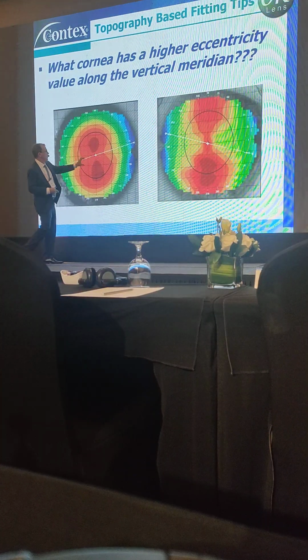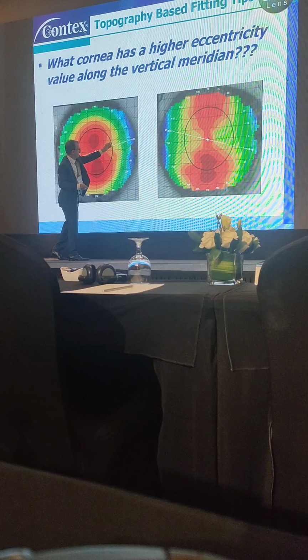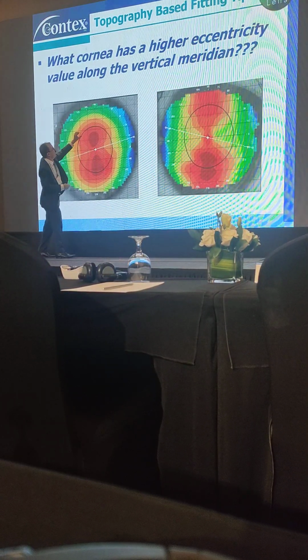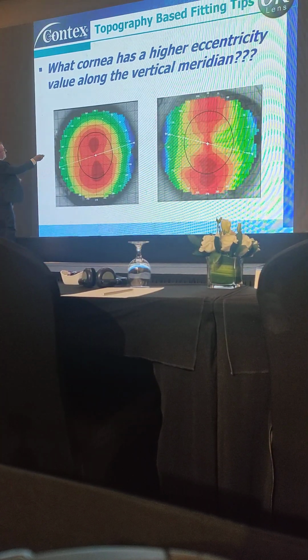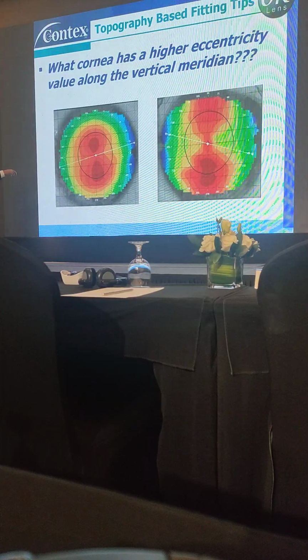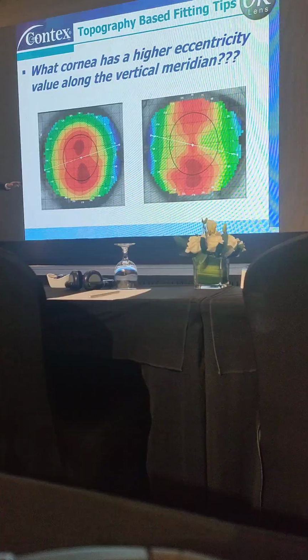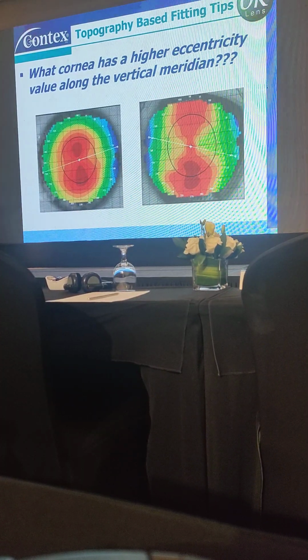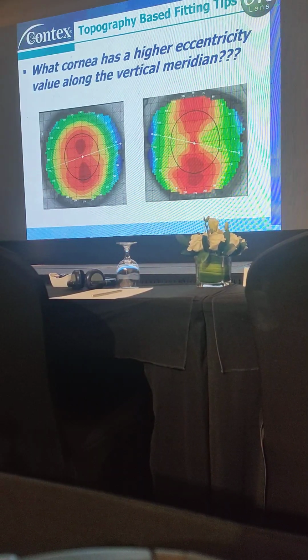So maybe we have the reverse curve coming around, and in this quadrant it's flatter, here we make it steeper, and then it's flatter again and steeper again. But the alignment curve, you can see that cornea is the same all the way around, right? Over here, it's not. So does everyone understand that? This is kind of elementary, Ortho K 101, right, TC?